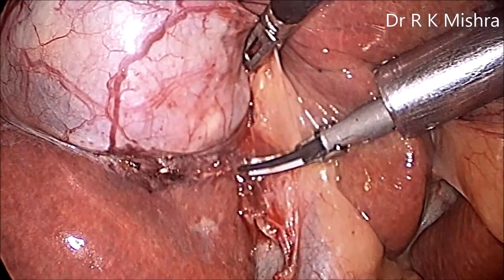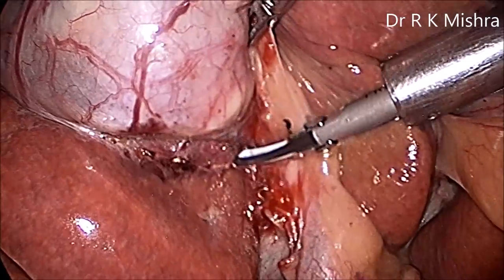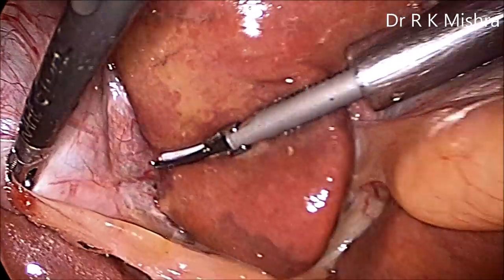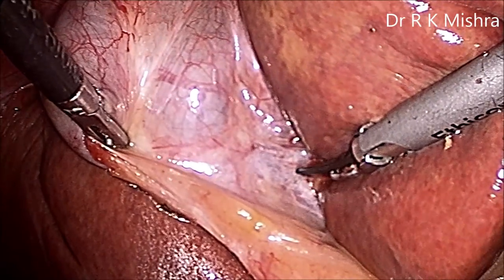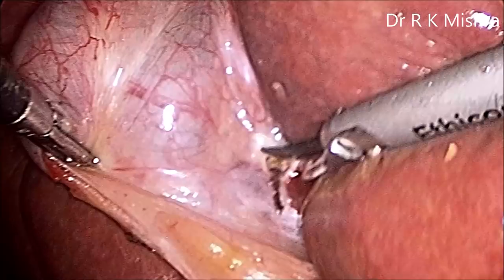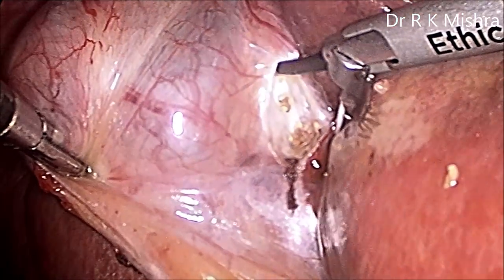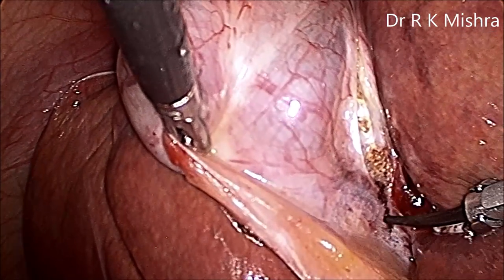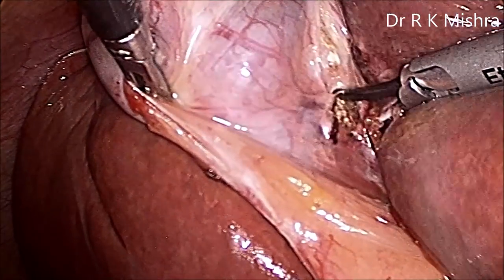Once the posterior peritoneum is open, you have to open the anterior peritoneum as well, and for that your left hand traction is very important — give anterolateral traction. The anterior peritoneum is separated slowly; just cut the peritoneum with the tip of the harmonic. As soon as you touch it, it will split — it breaks the hydrogen bond, automatically creating a blade that cuts the peritoneum alone without any underlying structure, beautifully opening your posterior window.